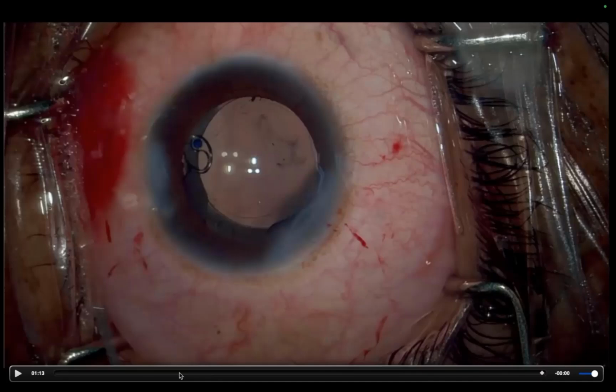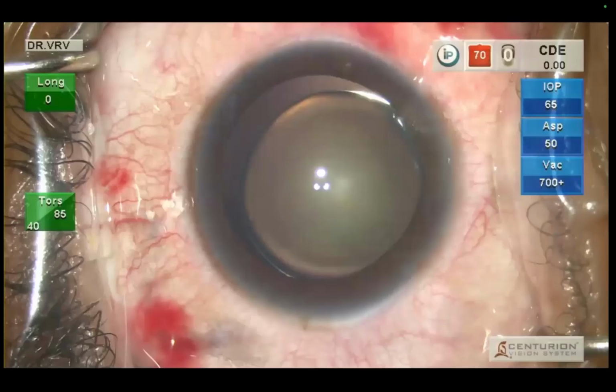In gross traumatic subluxation, you can do it, however gross it is. But when it is going to be a congenital anomaly, I will not recommend putting a CTS or something. It is better to go ahead with the secondary IOL implantation. In mild subluxation, it is fine. So you can do this.